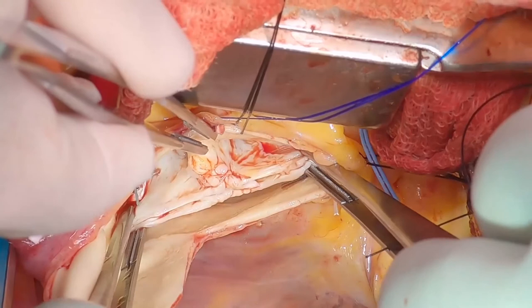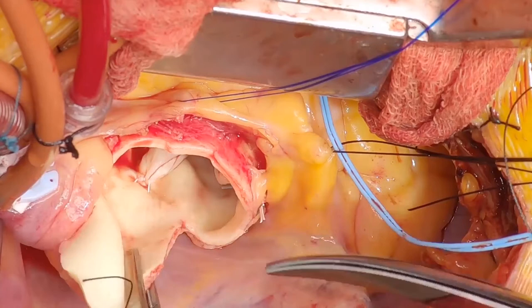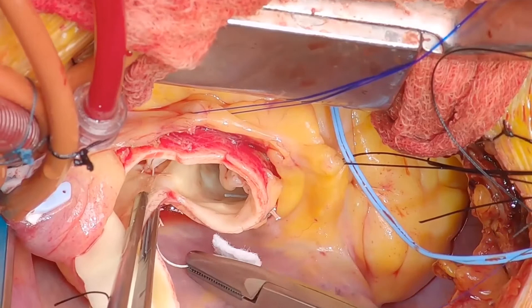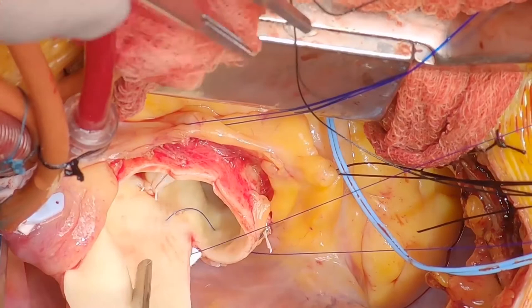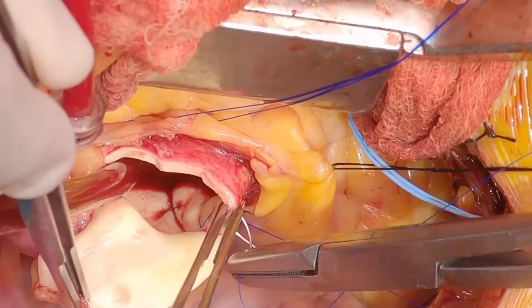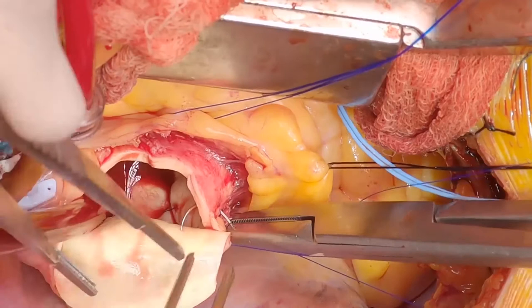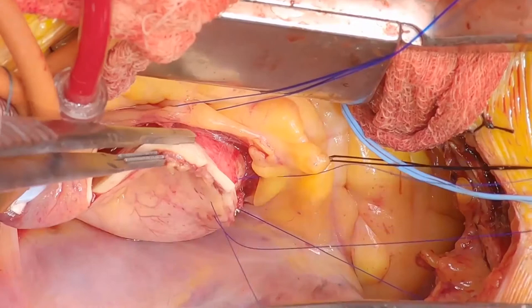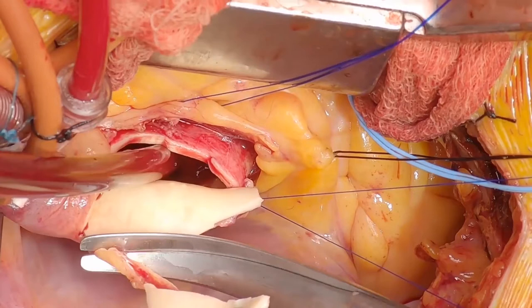Then you start closing up. In this patient, the aorta is a bit enlarged but not enough to replace it, so I'm going to do an aortoplasty. We've done a study on a big series of 400 patients in each group comparing ascending aorta replacement with bicuspid valve repair versus bicuspid valve repair alone. We don't see any difference in long-term durability — both methods coming in at about 95% freedom from re-operation at 10 years. Here's a piece of aorta being cut away, with an S-incision for the aortoplasty.